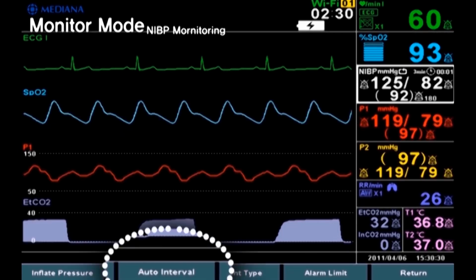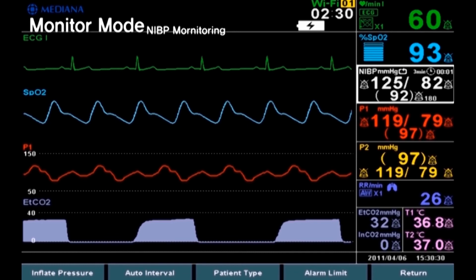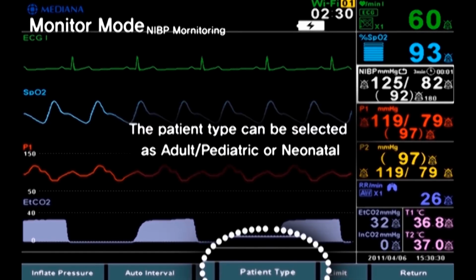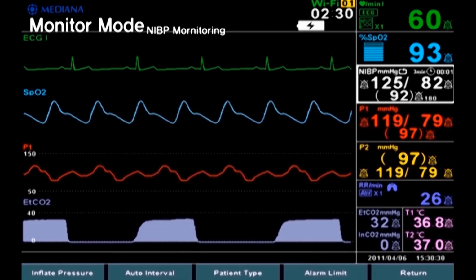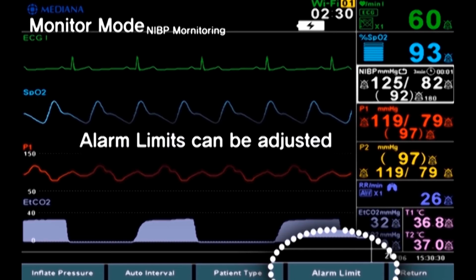Number 2, Auto Measurement Interval. The NIBP measurement interval can be selected as off, continue, 1, 2.5, 3, 5, 10, 15, 30, 60, or 90 minutes. Number 3, Patient Mode. The patient type can be selected as adult, pediatric, or neonatal. Number 4, Alarm Limit. Alarm limits can be adjusted.